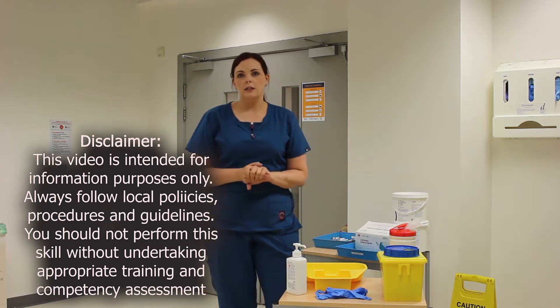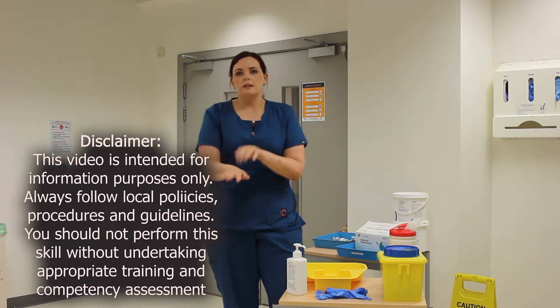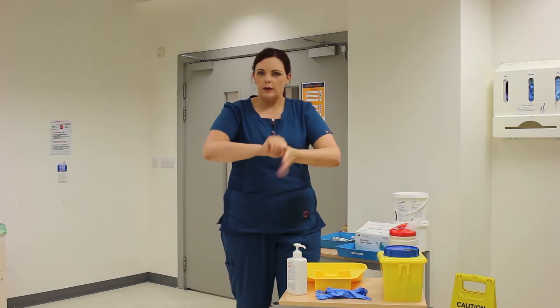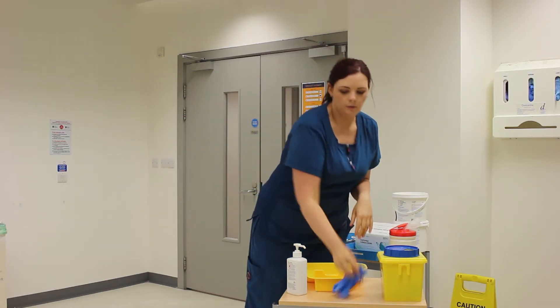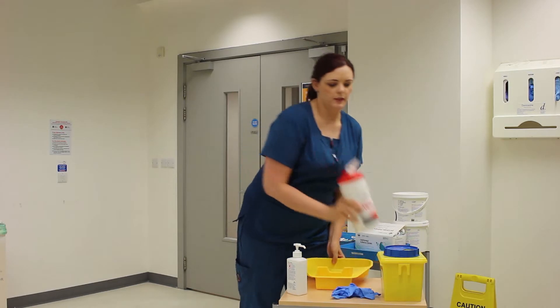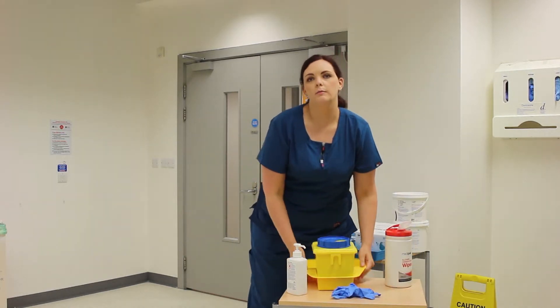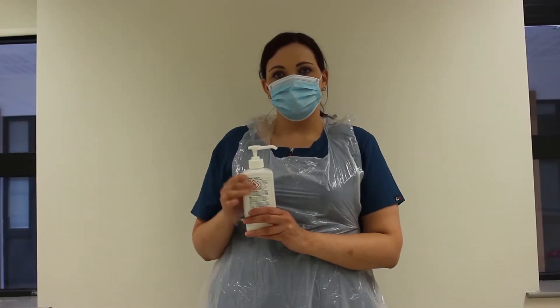I'm going to decontaminate my hands with 70% alcohol — we will have a video on this with the steps for hand hygiene. Once my hands are clean, I'm going to put on a pair of gloves and then decontaminate my tray with 70% alcohol. Once that's done, I can gather my equipment and begin the procedure.